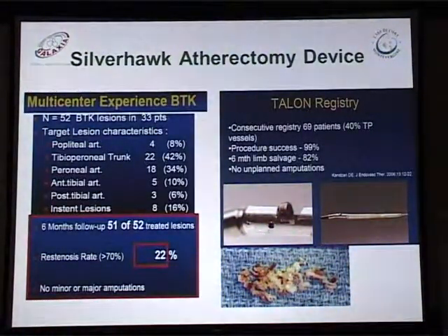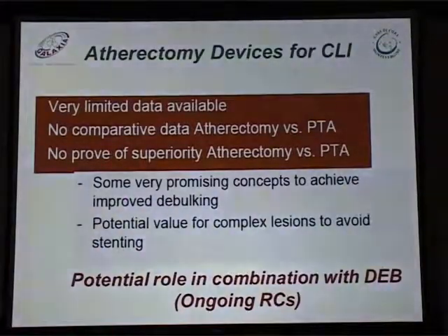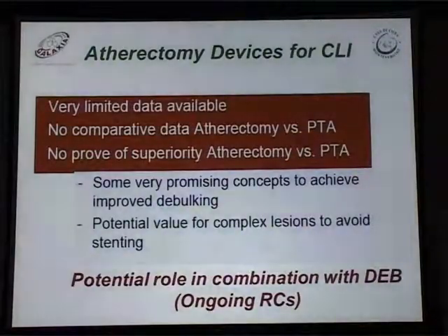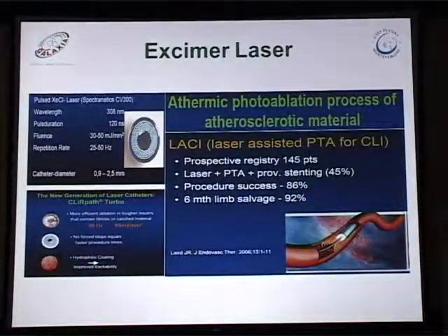Of course, we have, as well, a few data, a few studies. The potential value of this debulking system is to avoid stenting, and the potential role is in combination with drug-eluting balloon. Of course, we have few data comparing with angioplasty alone.